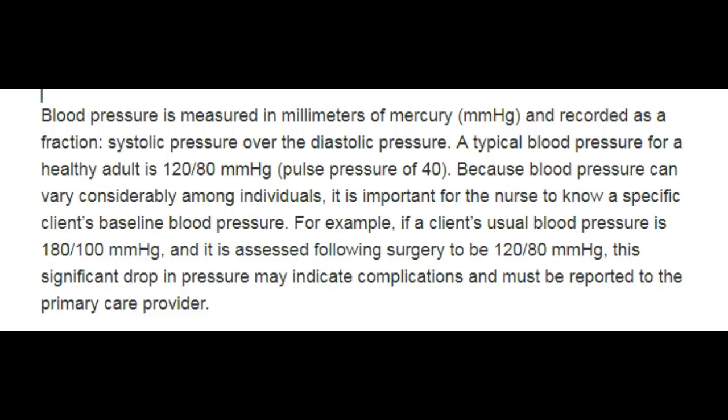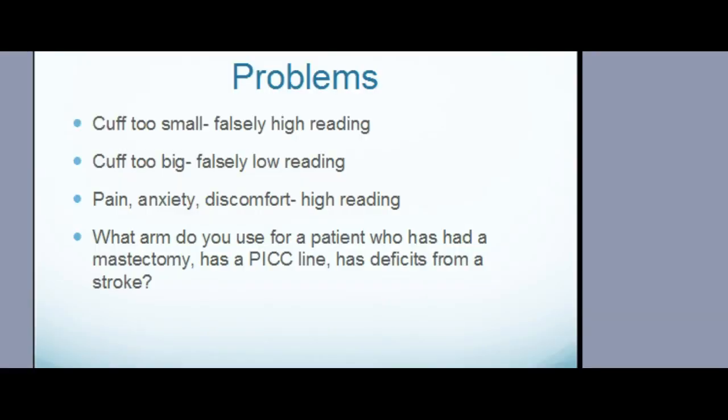I wanted to point out blood pressure is measured in millimeters of mercury, and this is how you write it. This is how you write your blood pressure, and I also want you to include your pulse pressure. Please read this example. There are always different things that can interfere with taking blood pressure readings. So look at this PowerPoint.